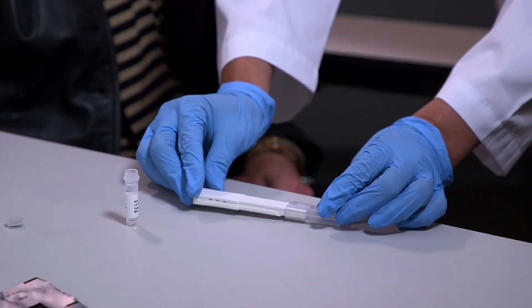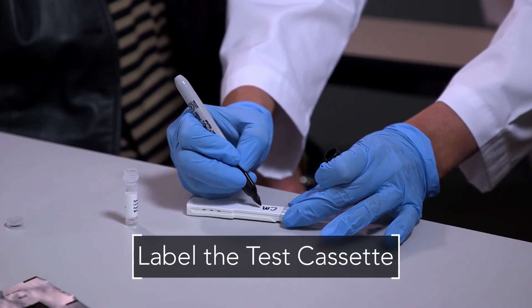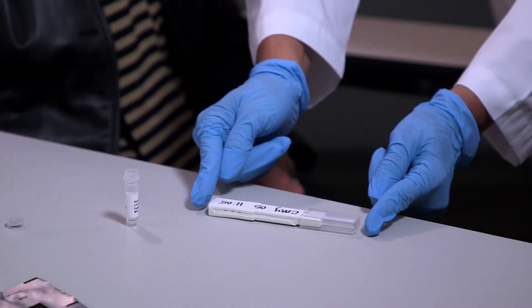Be sure to label the test cassette to identify right or left eye and the patient's name. Place the test cassette flat on a horizontal surface and set a timer for 10 minutes.